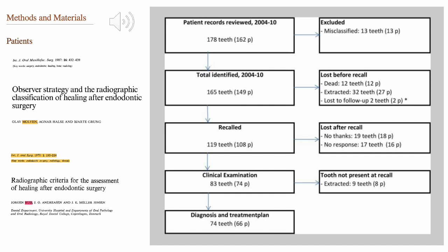However, only 74 patients with 83 teeth accepted the invitation, and the first baseline periapical radiograph was compared with a 7-year follow-up periapical radiograph and CBCT sections, and evaluated by 3 observers, 2 endodontists and 1 radiologist.